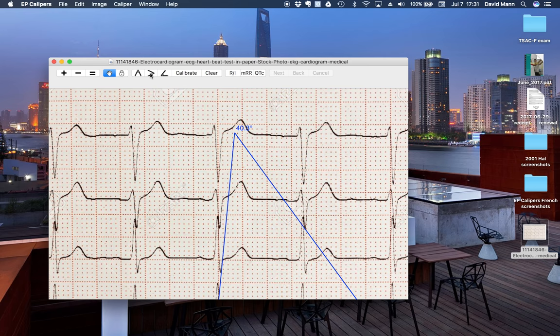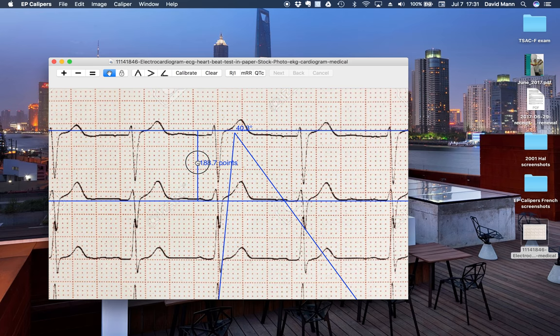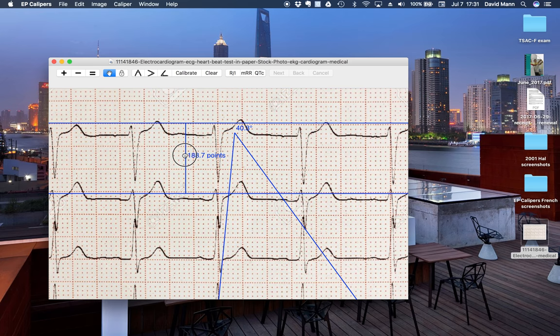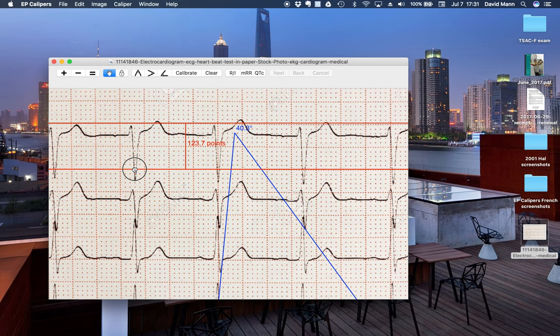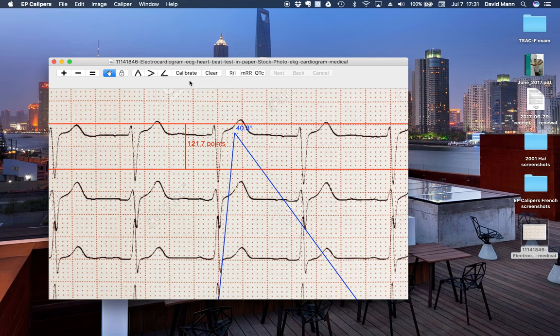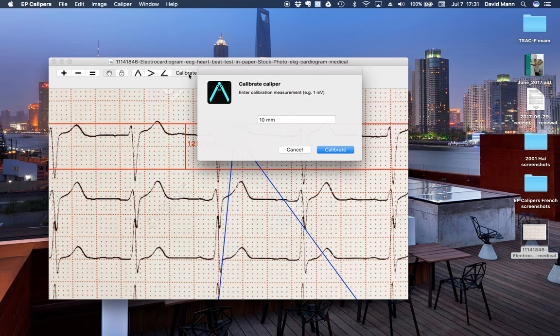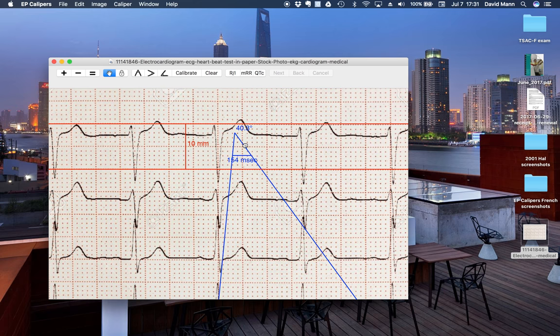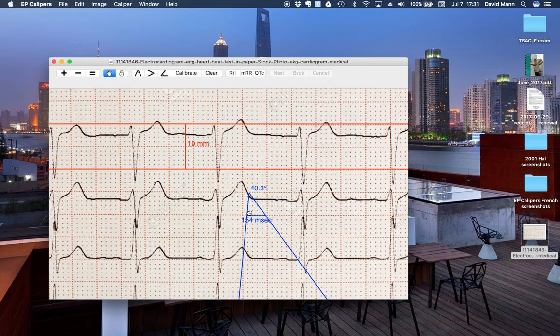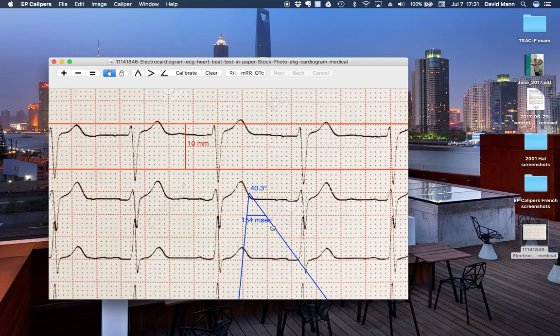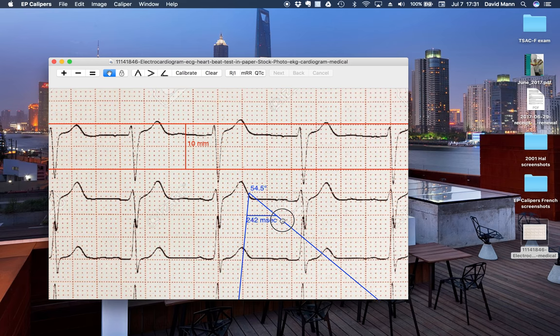You can also, if you calibrate the amplitude in millimeters, your angle caliper has a base of a triangle that is five millimeters below the apex. And this is something that's used to assess Brugada syndrome.